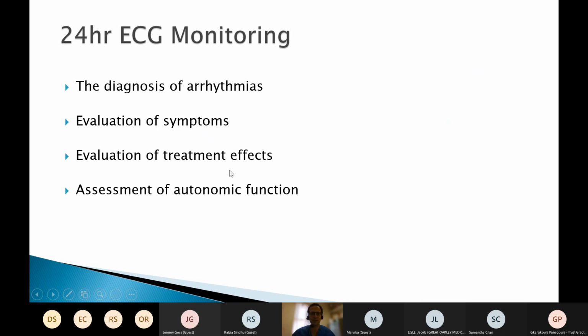We also might want to see, have those ventricular ectopics settled down. If in a symptomatic patient, they'll often tell you. So is there really any point in checking up on what the patient's told you? Not really, to be honest. But there are patients out there who, 25, even 50% of the time, are having extra beats. So when the heart's having extra beats as often as that, it can lead to inefficient function of the heart. And so we really want to suppress the extra beats in order to prevent development of heart failure. So we could repeat the monitor to assess that.